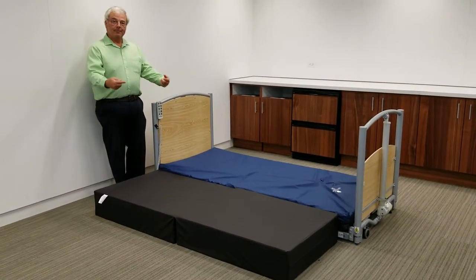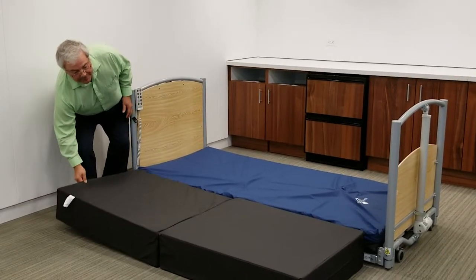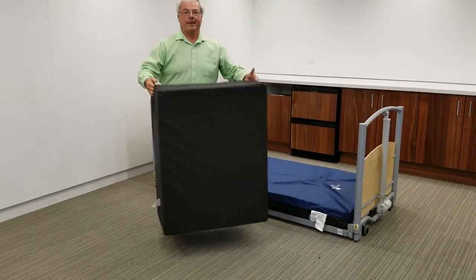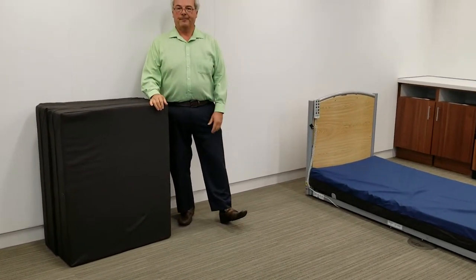The safety mat has a non-skid bottom, which will help prevent the safety mat from moving. It's also easily removed simply by flipping it up, picking it up, and moving it out of the way when the bed is not in its floor bed position or when the patient is attended.